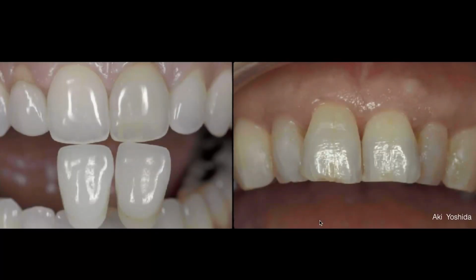And like I said to you before with one of the essentials that I showed you, the one all the way to the right of the screen, that was probably the most difficult one for me to make. Why? Same reason that Aki is using this as an example. What he's trying to show here is that even though these two teeth are slightly different colors, to really make one of these teeth blend, if I wanted to make the number 9 or the 2-1, this would be one of the most difficult teeth to make.